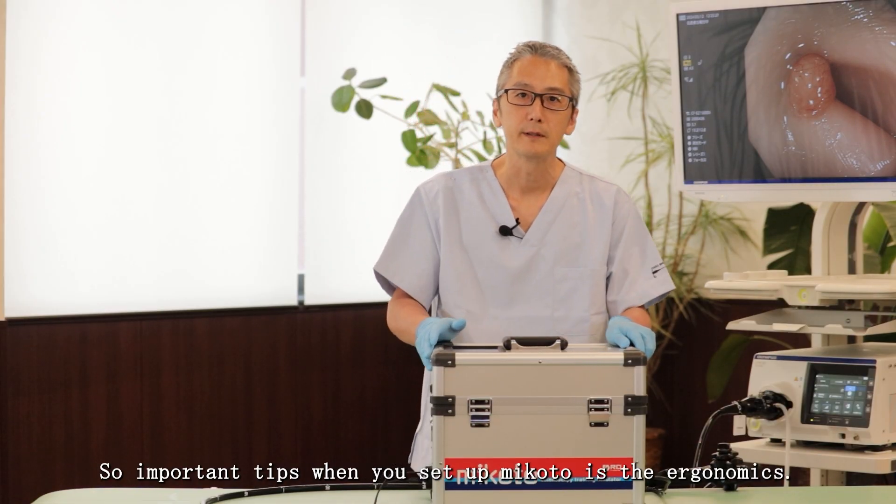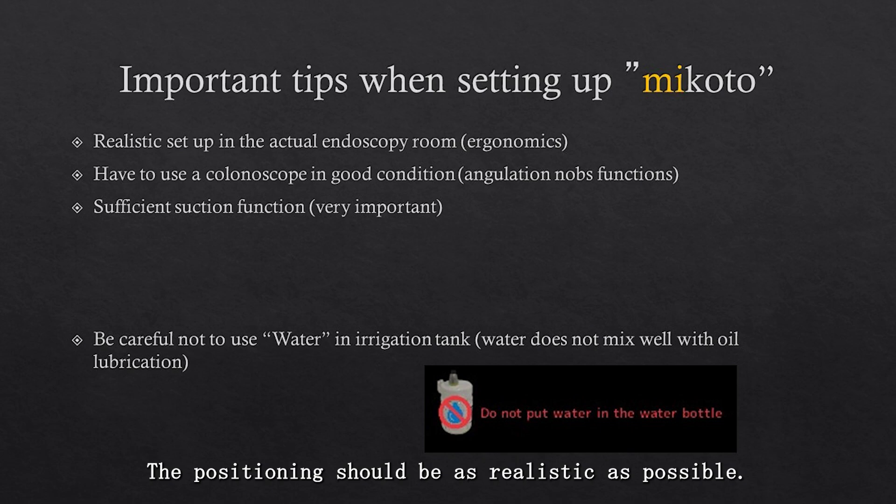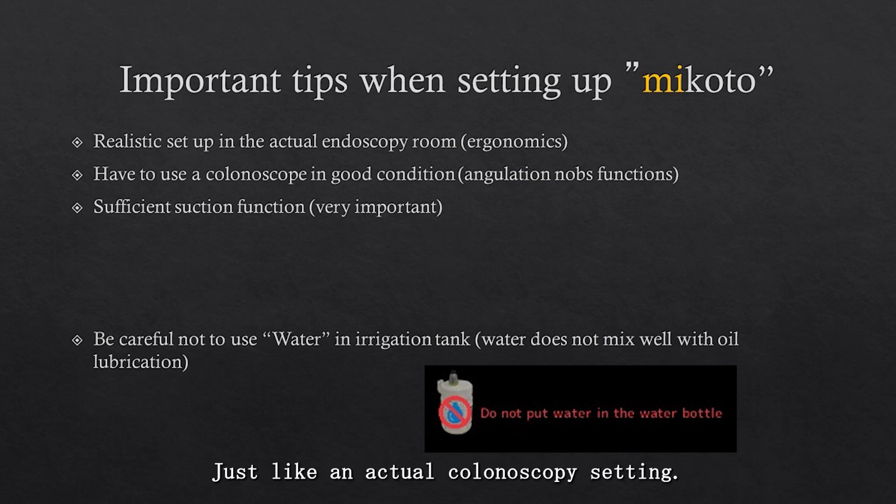Important tips when you set up Mikoto is the ergonomics. Positioning should be as realistic as possible, just like an actual colonoscopy setting.